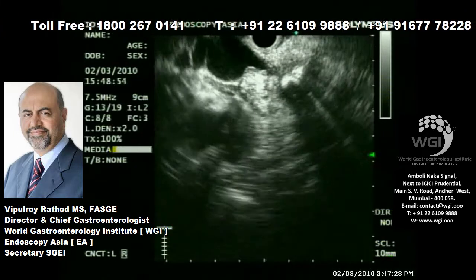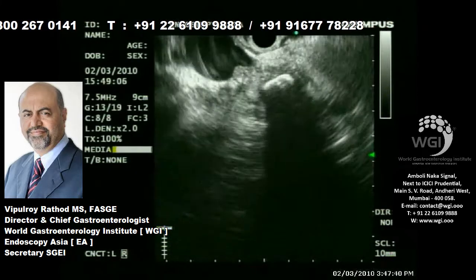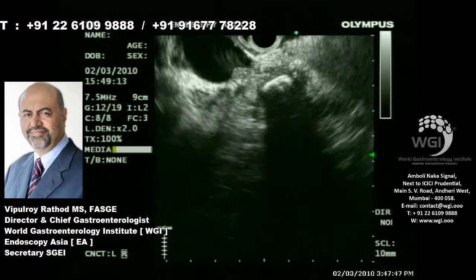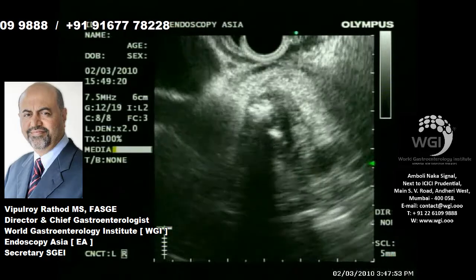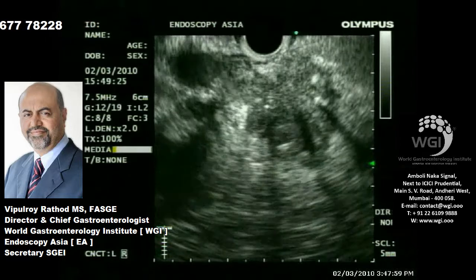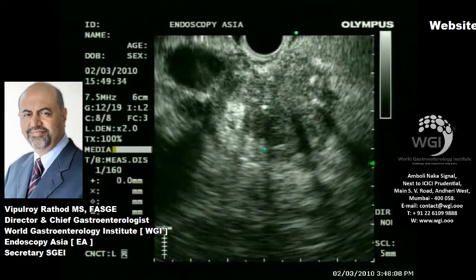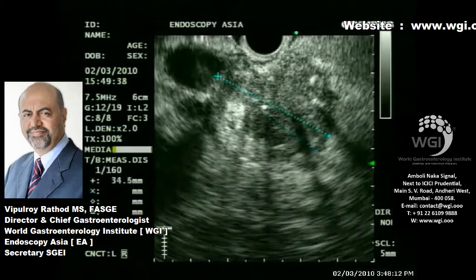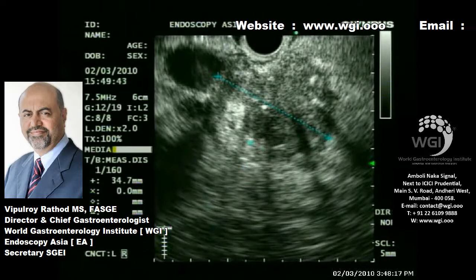We have switched over to a linear echo endoscope to carry out EUS-guided FNA from the suspicious hypoechoic lesion which is occluding the bile duct. You can see a dilated CBD with an irregular stricture and hypoechoic areas with surrounding calcification. We are measuring the lesion again, and this is our target site for EUS-guided FNA.